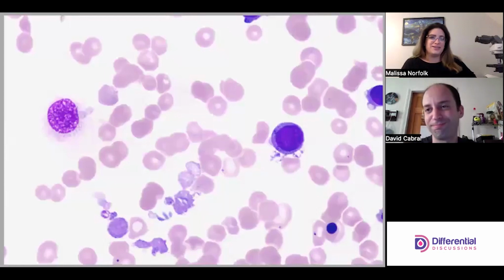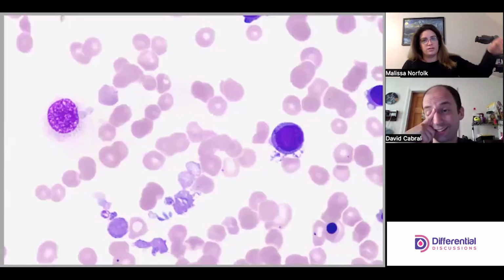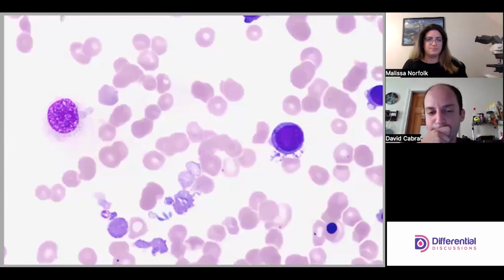Today we're going to look at megakaryocytic leukemia. So an M7, AML M7. Under the WHO classification system, it would be not otherwise specified M7. And this is definitely a slide when I sit at the scope, right?